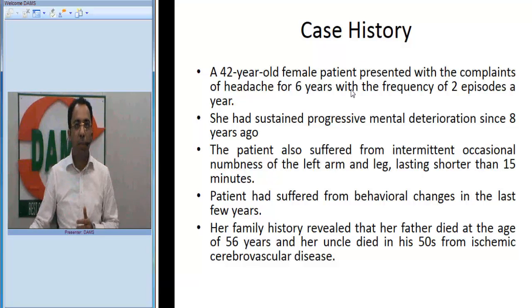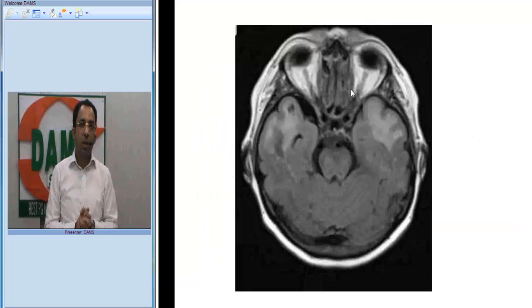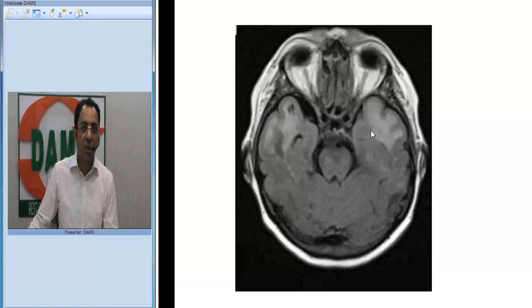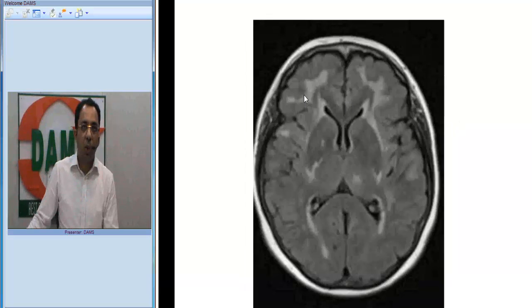An MRI brain was advised. Looking at this first FLAIR MRI image, you can see abnormal signal in the anterior temporal lobe. There are also confluent subcortical white matter abnormalities more so in the frontal lobe and around the lateral ventricles, and you can see abnormal signal along the external capsule.